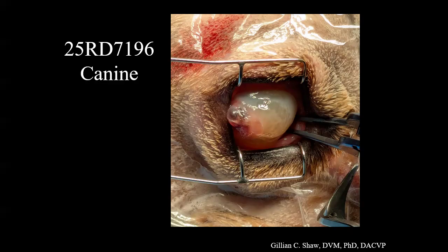Alrighty. First up, we have a 4-year-old spayed female Pembroke Welsh Corgi. The history that we got: there's no gross photo, but we got this beautiful clinical photo.